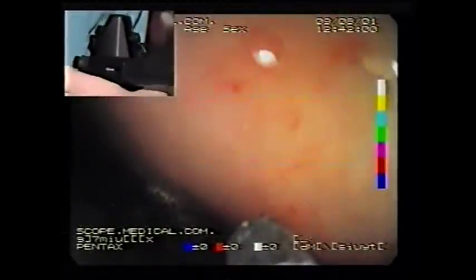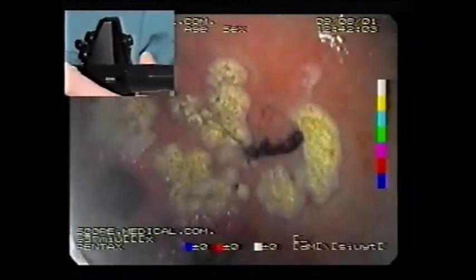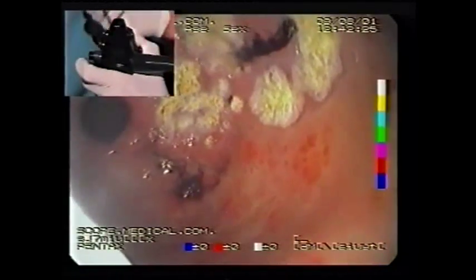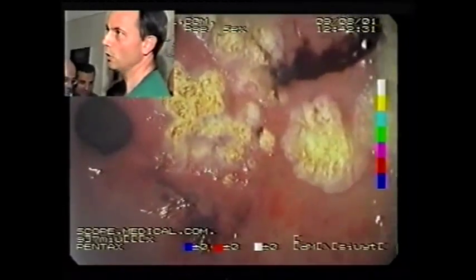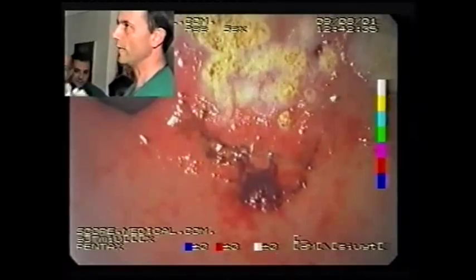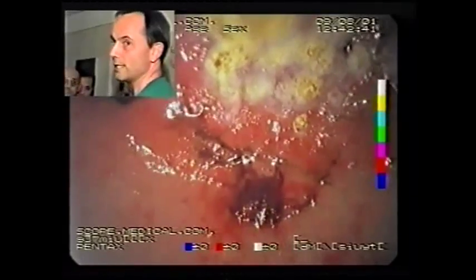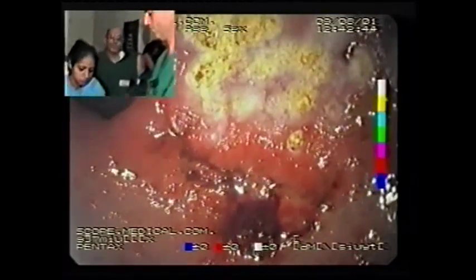So I stay. At which time do you stop? Usually after 20 or 30 minutes, I think it's enough. But now again, maybe we have to clean the tip. Clean the probe? Yeah, in between. Is it only the time that limits you, or is it related to some surface area? No, I'm not anxious about creating a too large area of coagulation. I think it's clinically irrelevant if the patient is under PPI.